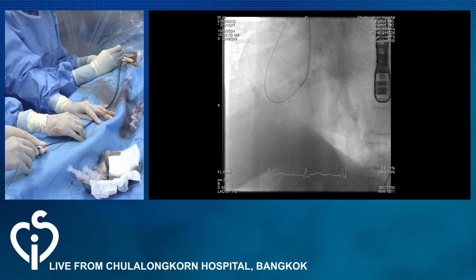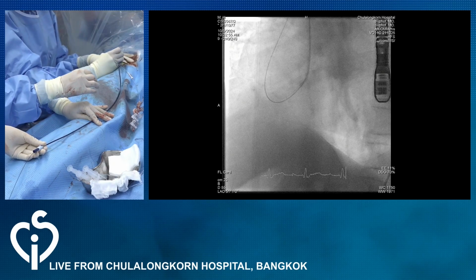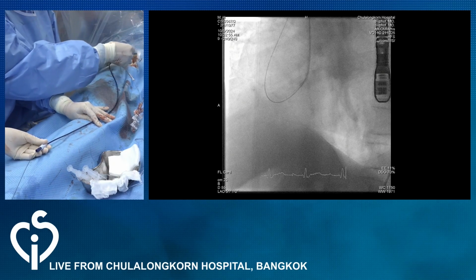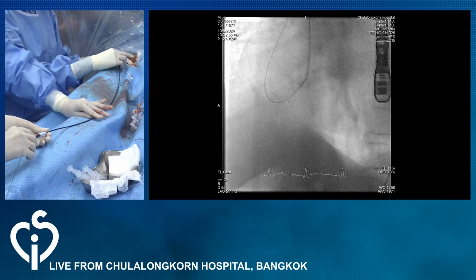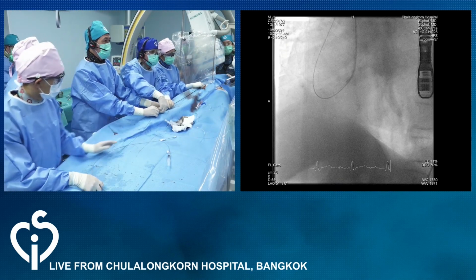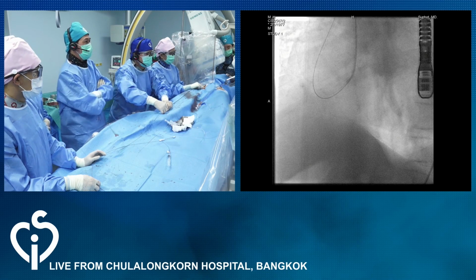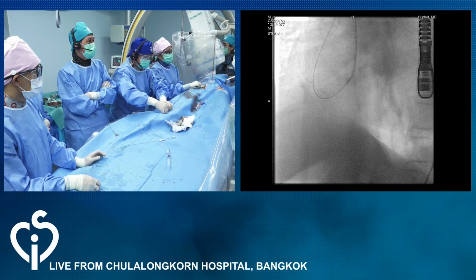And in the audience, show of hands, number one, ADO1. Okay, ADO2, much smaller number. MFO, also a smaller number. ADO1, I don't think Nageshwar's vote counts at all. Oh, all right. Nageshwar, jump up and down. All right.